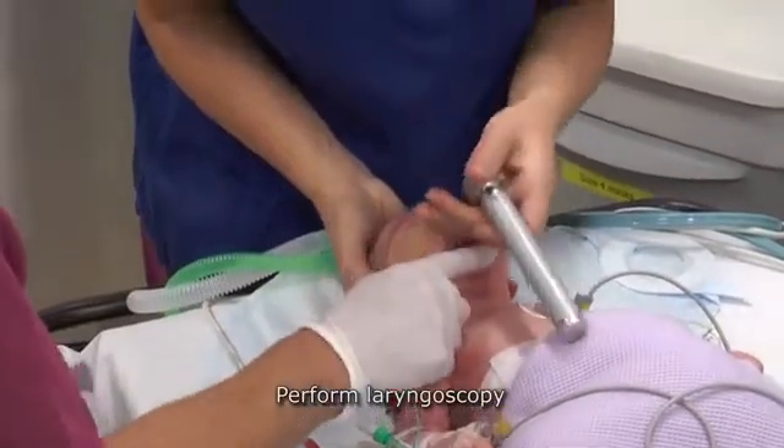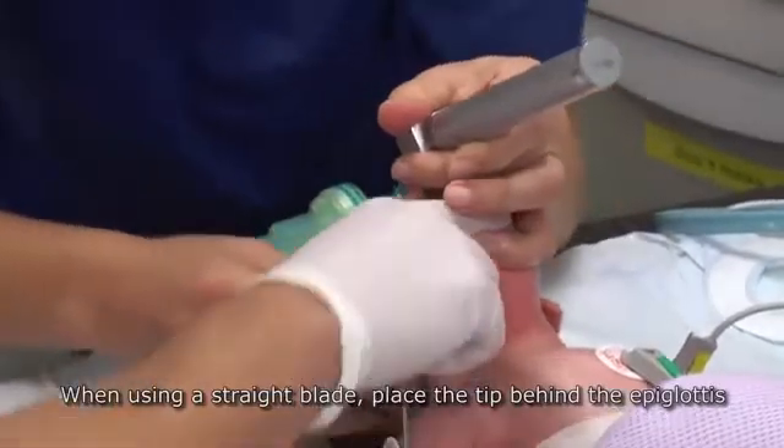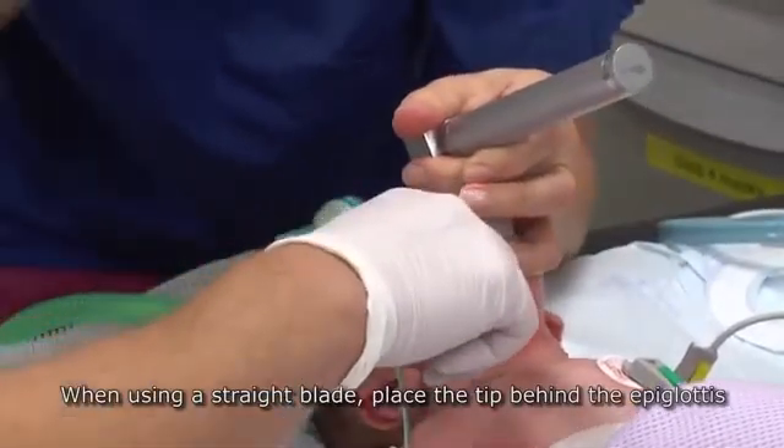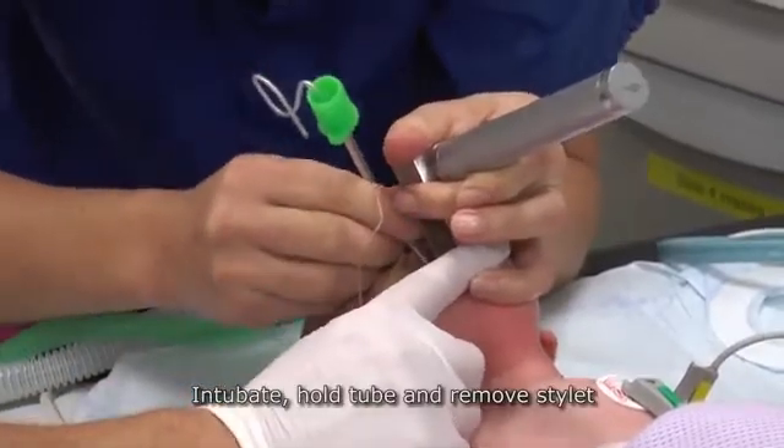Perform laryngoscopy. When using a straight blade, place the tip behind the epiglottis. Intubate, hold the tube and remove the stylet.